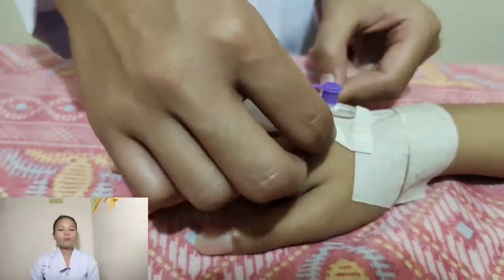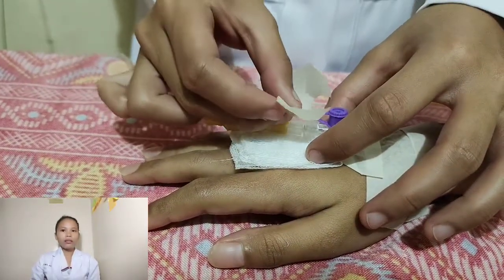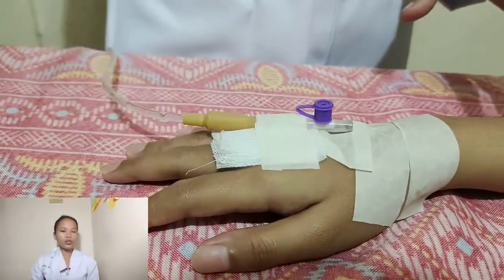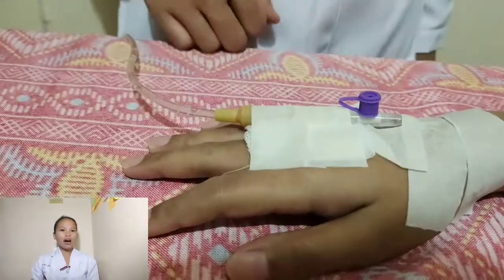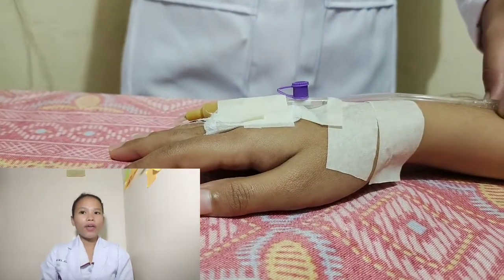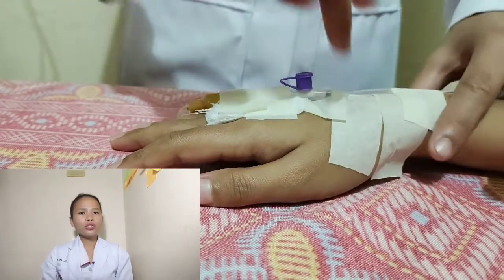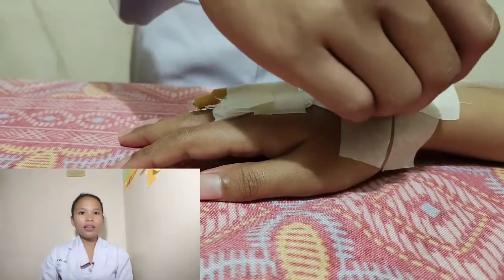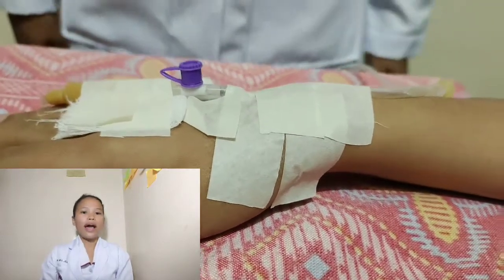Insert the needle with a small piece of gauze or tissue paper under the hub if necessary to keep the needle in place. The smooth structure of the vein does not offer resistance to the movement of the needle. The weight of the tubing is sufficient to pull the needle out of the vein if it is not anchored. Loop the tubing near the site of the entry and anchor it with plaster to prevent pulling of the needle.